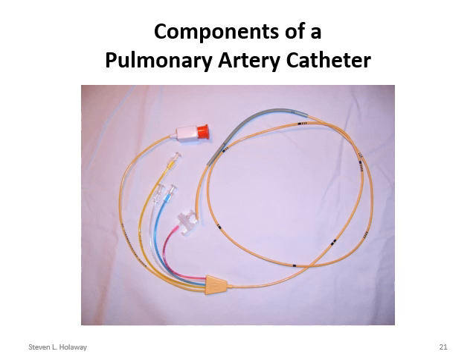Now, this is what a pulmonary artery catheter looks like, and I've got some better slides, but basically you can see multiple ports. This is for the thermometer. This is the yellow port, which is usually connected to the transducer to measure the PAP pressures. A white or clear port, which is used to actually give fluids through. Blue port is connected to a transducer to monitor the CVP. The red port here is the balloon port. There is no fluid that goes into the balloon port. Basically, only air goes into that port. They all terminate at different points on this catheter.